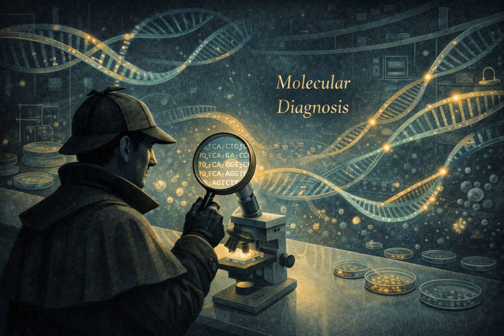It's not just about knowing what PCR stands for. It's about knowing why you'd use it for a viral load, but might hesitate to use it for a test of cure. There's a big difference there. And we need to get very clear on the difference between detecting the organism itself, which is what we're talking about today with molecular methods, versus detecting the host response, which is serology, a whole different can of worms. We also need to understand the shift from slow, old-school biochemical identification methods to the lightning speed of things like MALDI-TOF.